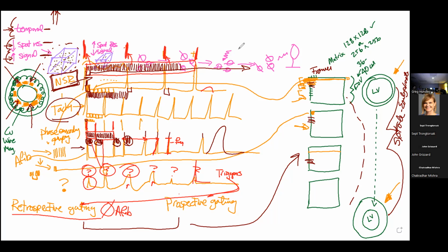So what do we do then? Why in the world would I have talked about all this temporal, spatial, and signal stuff? Well, the last form of imaging that you can switch to is called real-time or snapshot imaging. Instead of the retrospective, prospective, very nice spatial resolution, very nice temporal resolution, beautiful signal, you can switch to a technique, because you're likely at a site doing some high-end work with a very nice scanner. You can try to capture the entire movie in time. So now you're capturing not phase encodes, but the whole frame in intervals of time.